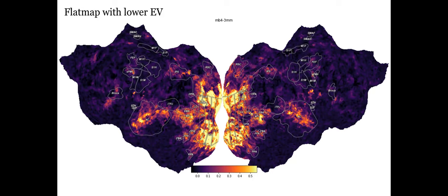We didn't do that, but I think that would be a good idea. So maybe, for instance, just subsetting by auditory cortex, or early or late visual areas, or high level semantic areas. I think it would also be particularly useful if for a certain experiment you're just studying effects that you would expect in maybe only visual cortex. Then maybe you don't really care if SNR is really bad in precuneus or something like that. You maybe just care if it's really good in visual cortex. But yeah, we didn't do that for this.